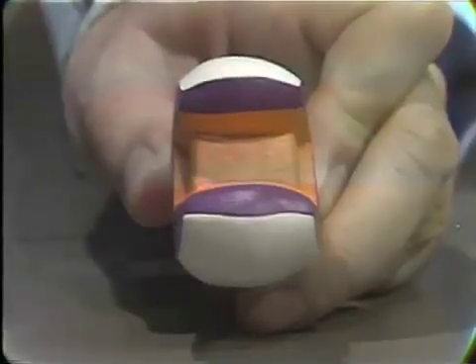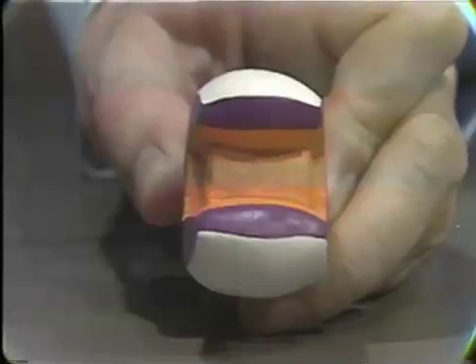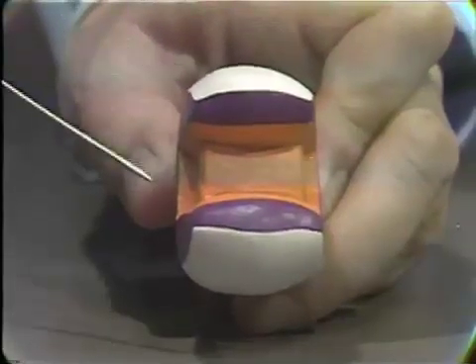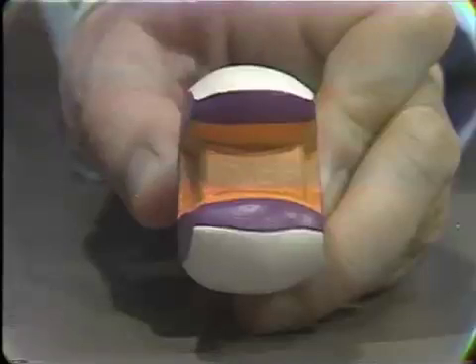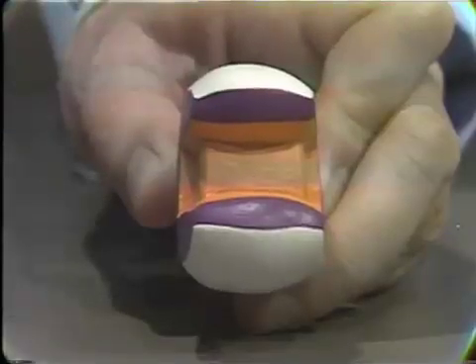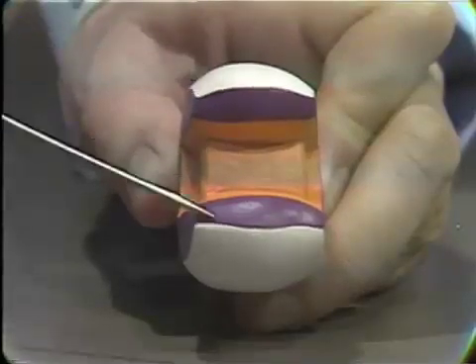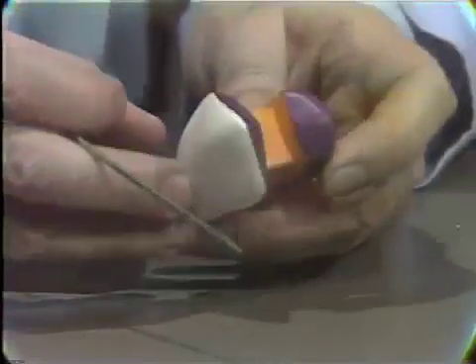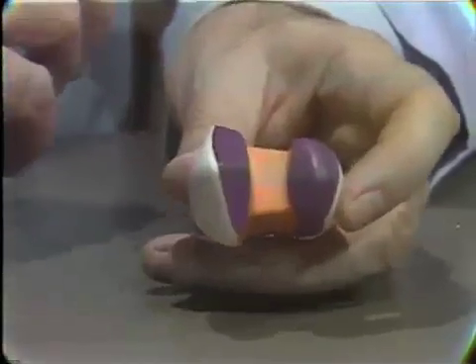And you see here a typical MOD preparation in a bicuspid tooth with slices on both mesial and distal surfaces, and the box type of retention going across the occlusal key here with occlusal protection of both buccal and lingual cusps. Another modification of that situation is seen here and is often used in the maxillary first bicuspid.